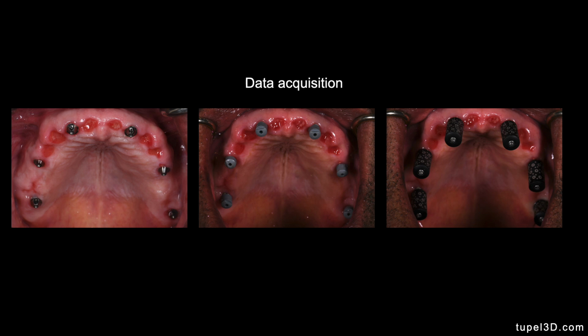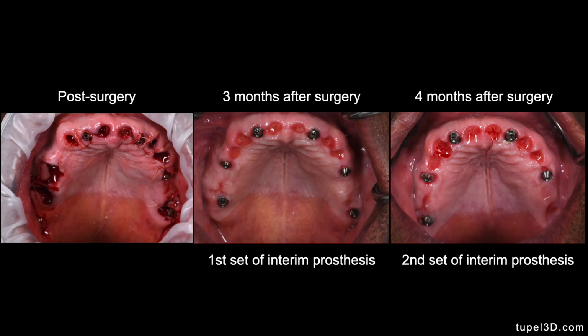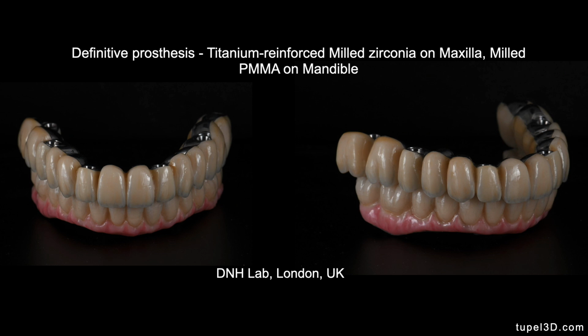3 months after surgery, we then do data acquisition and intraoral scanning, and then photogrammetry. And these are the type of interim prosthesis I'm able to fit just 3 months after surgery. And then you can see how I have a first set of interim prosthesis right after surgery, which I keep 3 months, and then once the implants are fully integrated, then I provide a second set of interim prosthesis that can basically improve the shape of the fitting surface. Okay, so then when I fit the definitive prosthesis, I know there's not excessive pressure on the mucosa.